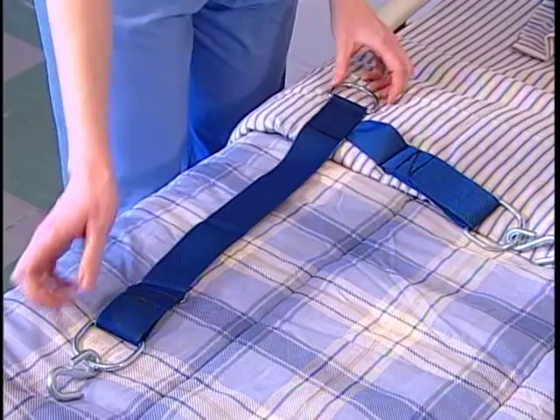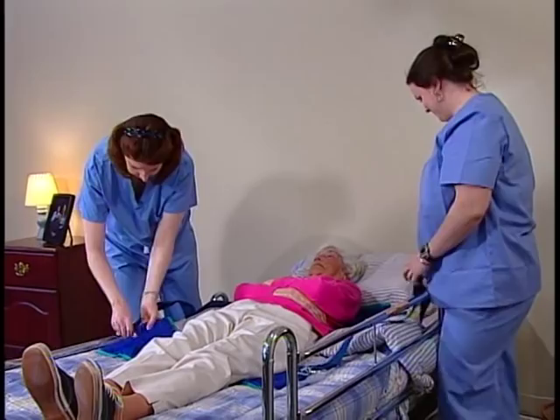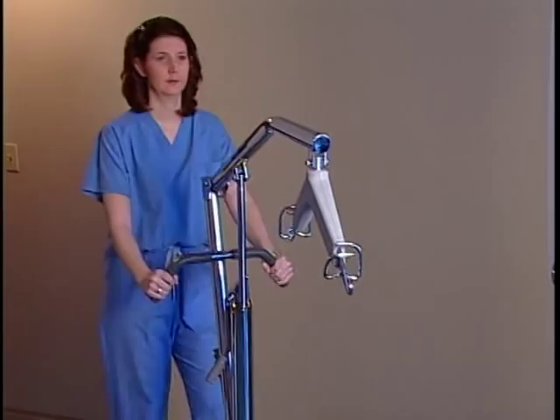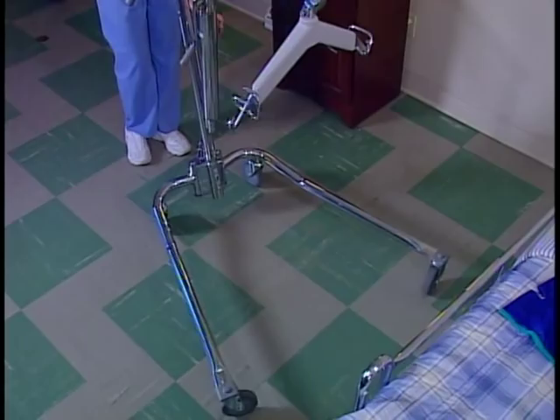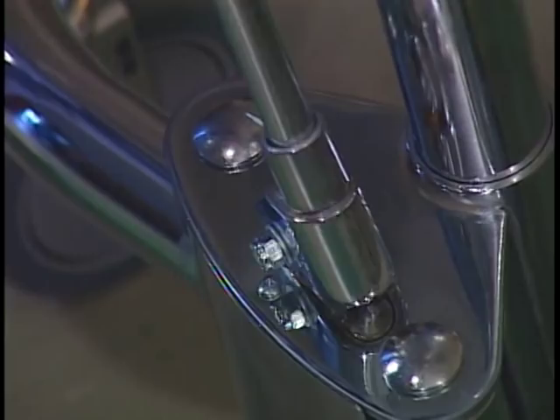The resident is now ready to be lifted. While one caregiver stays with the resident, the other caregiver gets the lift. Before rolling the lift into position, lock the legs in the full open position. If the shifter is resting securely in the notch on the right, the legs are fully open and locked. Make sure that there are no obstacles under the bed.